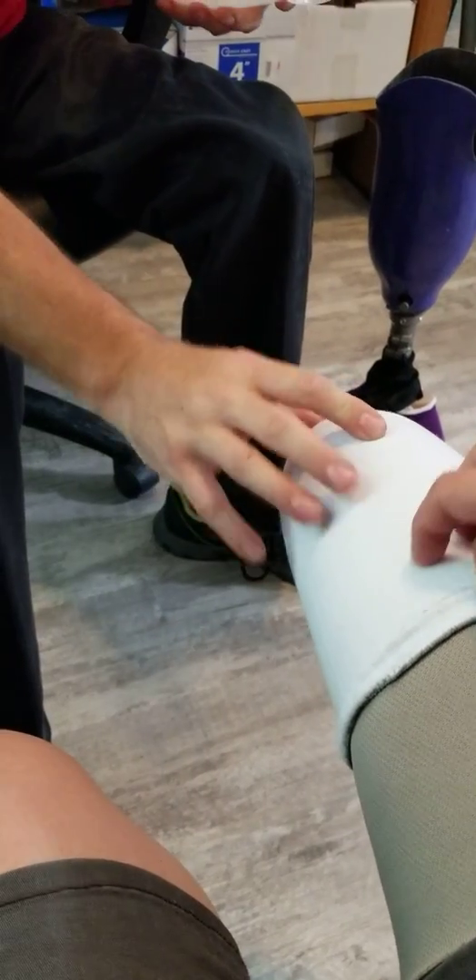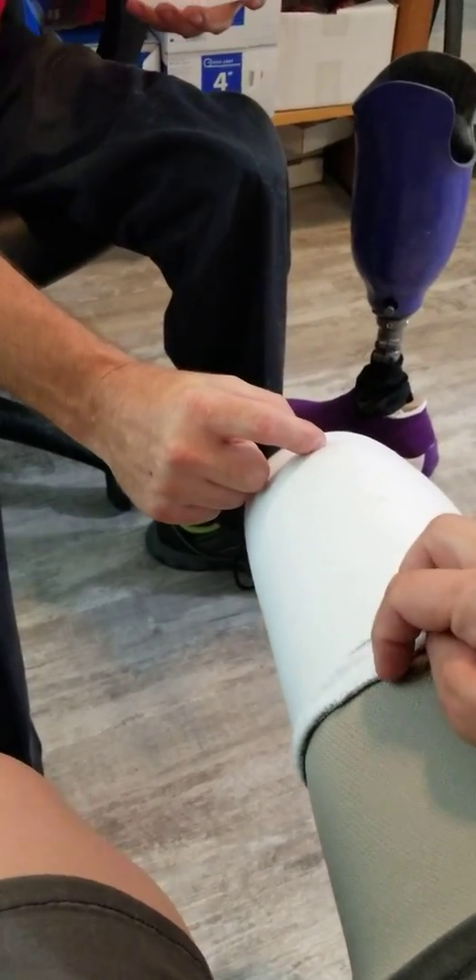It's right at the end of the bone — you can see where the end of my bone is. This whole area is going to shrink up. I know that, but you can see that's the part where I'm hitting it.